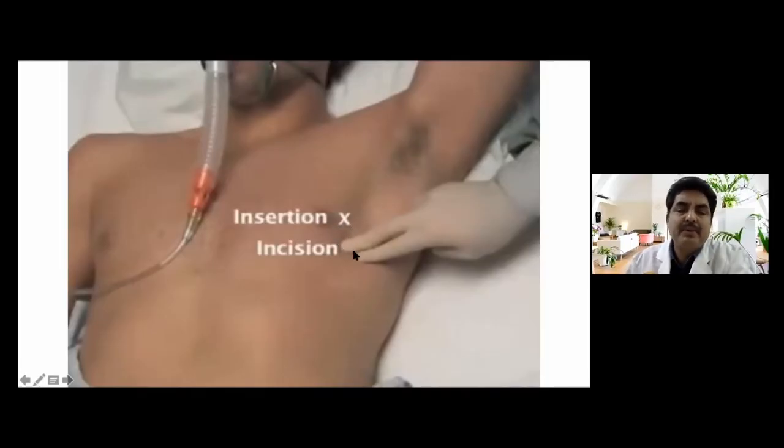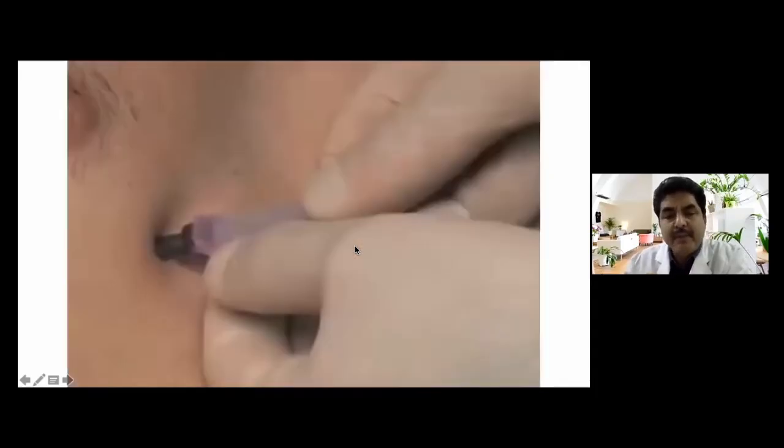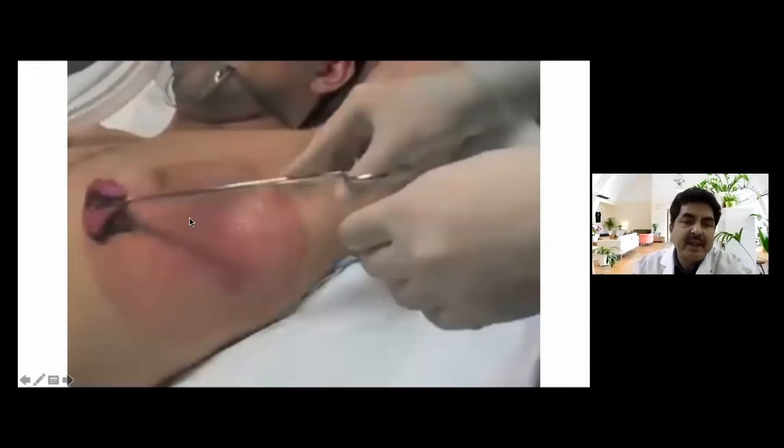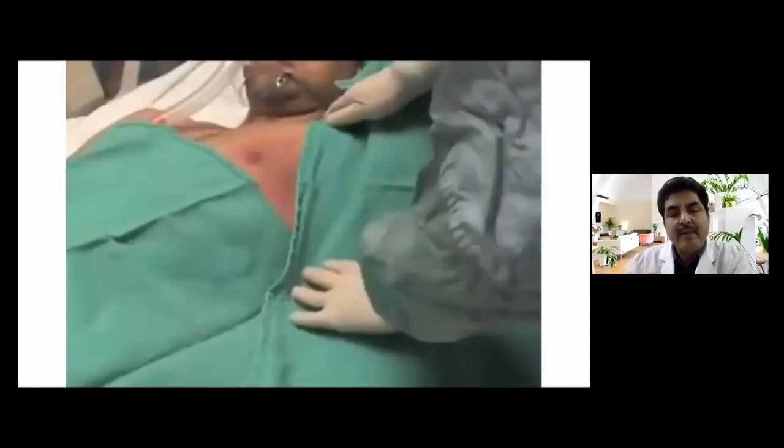You need a marking before going for the incision. How can you put a mark? Like this, either with gentian violet or any sterile ballpoint pen, you can mark the site of insertion of the tube, because the site is important for safety. Then you need anesthesia. Before anesthesia, we have to paint the operative field. This can be done with chlorhexidine, or you can do it with povidone-iodine. As we practice, the standard is povidone-iodine, you can wash the operative site with it. Then the important part is the draping. You can put another draping sheet over here, or you can put a large eye shield over here, or you can do the conventional thing. We usually prefer the conventional draping.